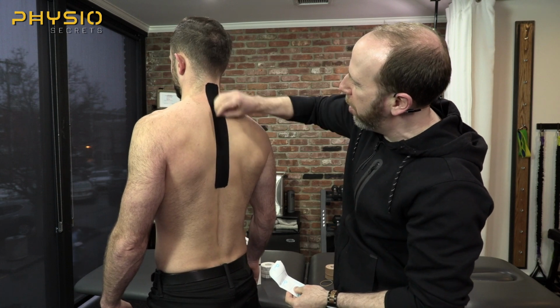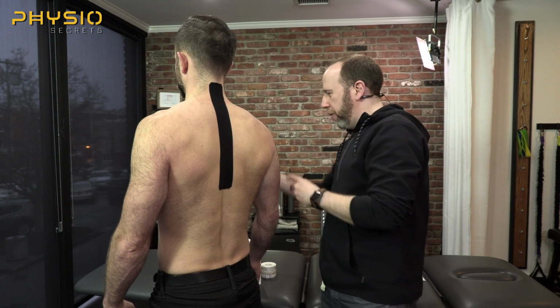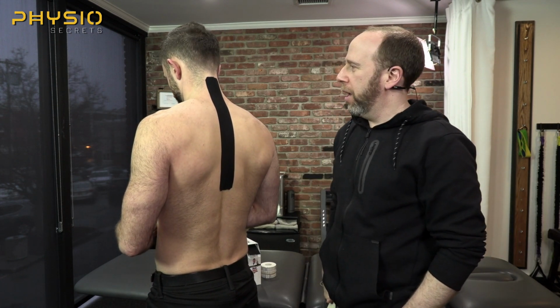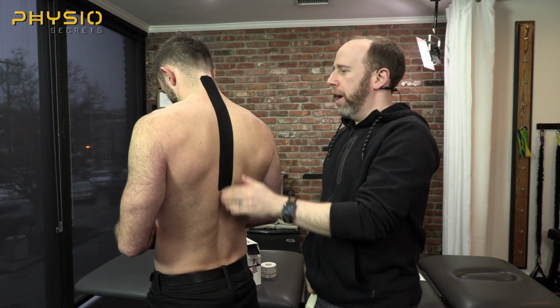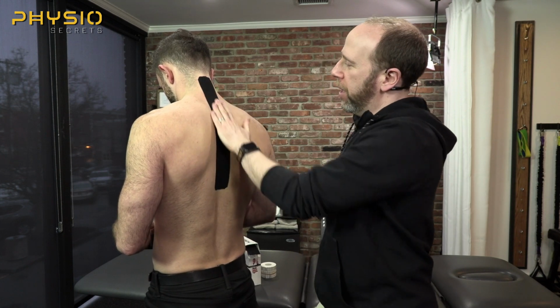Let's heat the tape up a little bit. Okay. Now, let's pretend this is your cell phone. Hold that. Okay. And look down at your cell phone for me. You feel the tape pulling, yes? Yes. Okay. Now, can you still look at your cell phone? Yeah, I can. All right, now here's what's going to happen. Let's say for 1 second he disobeys the tape.